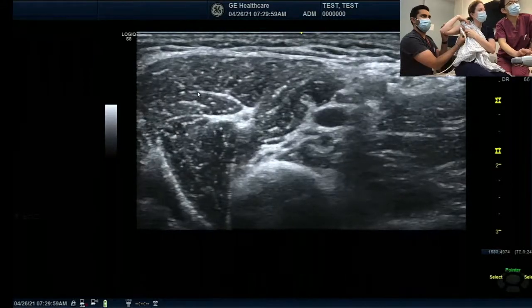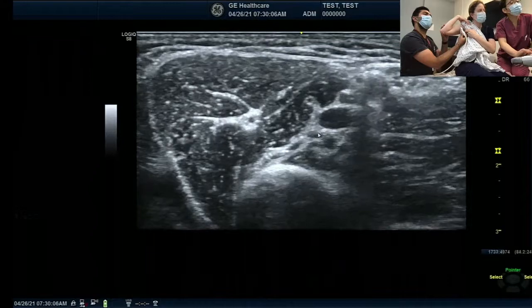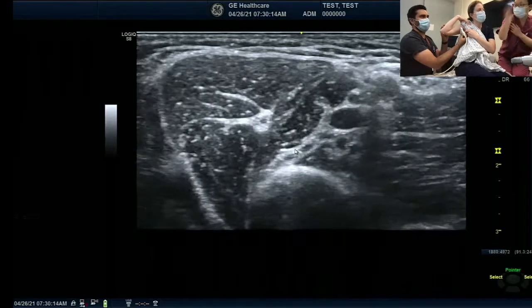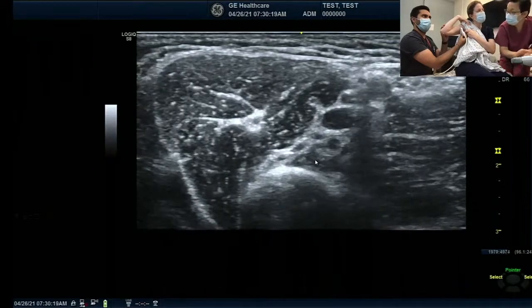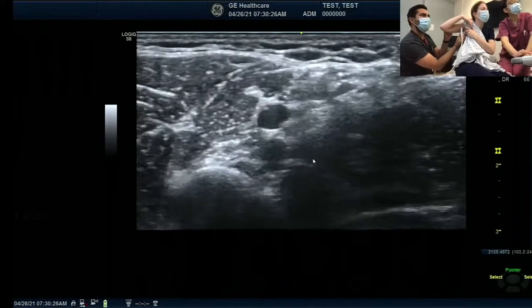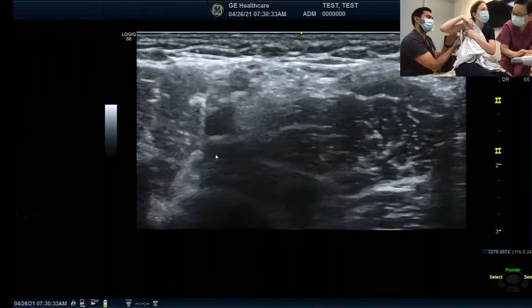Above is the short head of the biceps. Underneath is the coracobrachialis. And this is the conjoint tendon, which is the teres major and latissimus dorsi. I showed that in a picture drawing, right? Yeah, how it inserts. And now you're going to go to the posterior part to the radial, follow the radial nerve. Slowly move from there. Radial nerve is moving, I see here. It's going to be hard for us to go to the posterior part.